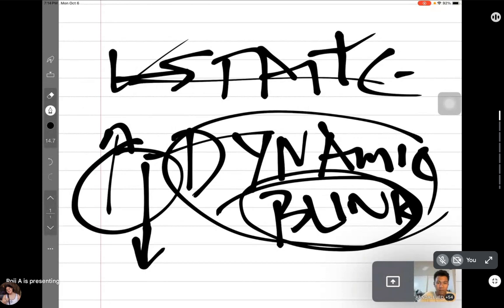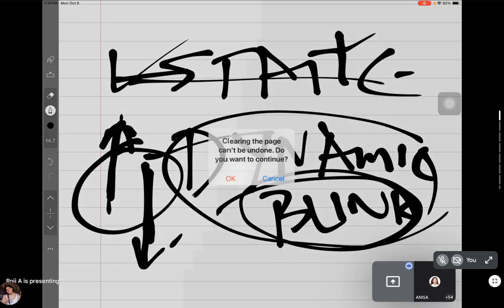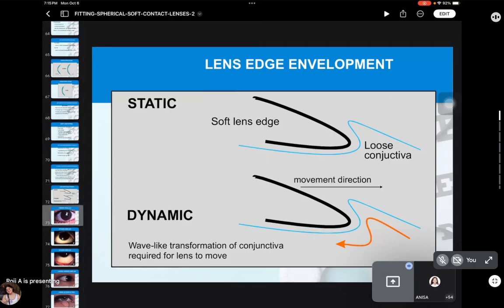In contact lens, when I ask the patient, in your primary gaze, look straight, blink, blink, so I'm already doing dynamic, right? Yes po. But when I say, Anissa, when I say blink, hold, meaning to say stop blinking, I am now assessing static. Correct? Yes po, Doc. Super clear on that? Clear po, Doc. Yes, very good.